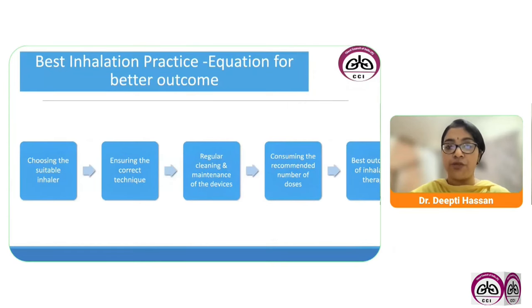So the best inhalation practice is an equation for a better outcome. What is it? The equation is: choose the right inhaler. Ensure that the correct technique is done. Regular cleaning and maintenance of the device has to be taught. Consuming the right recommended number of doses, and ultimately it leads to the best outcome.